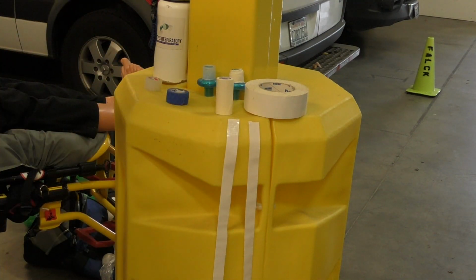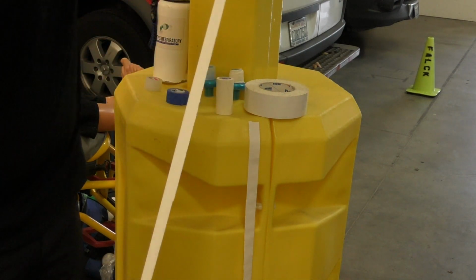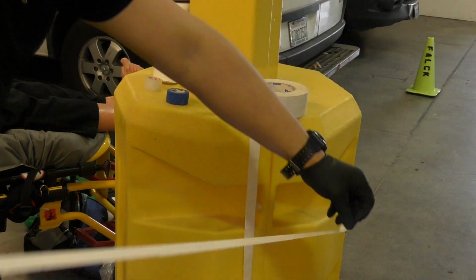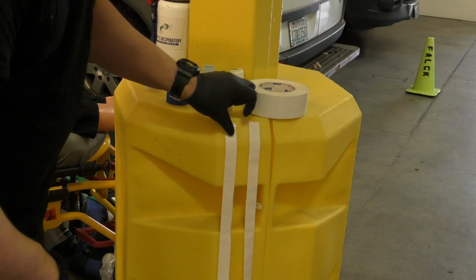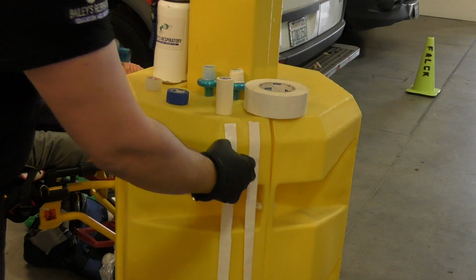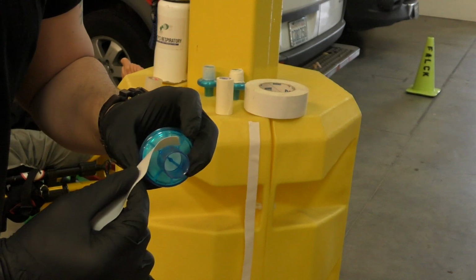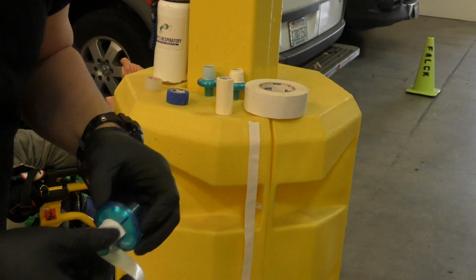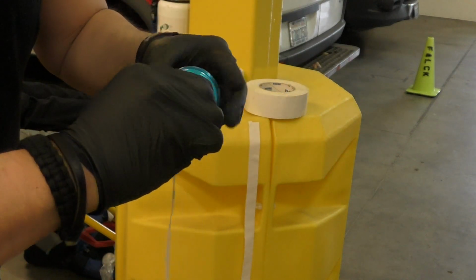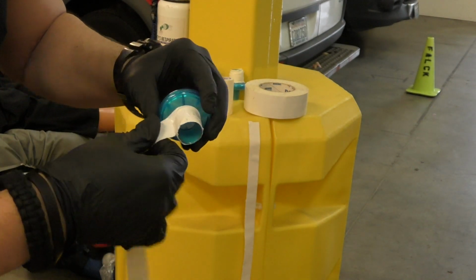Then we have our duct tape. You notice I already cut out about two strips, and I would say this is about 3 feet, about a meter. I'm going to slice it in half just so it'll fit on the area there, and I'm going to use both of these. Now the duct tape, you still kind of have to get it right. You don't want to put a lot of holes in there, okay?